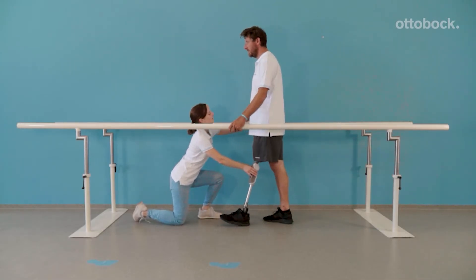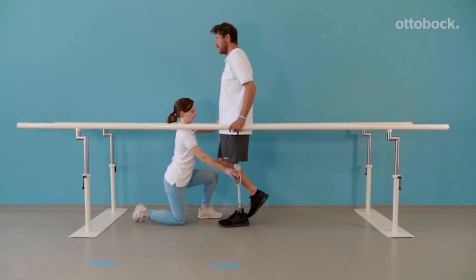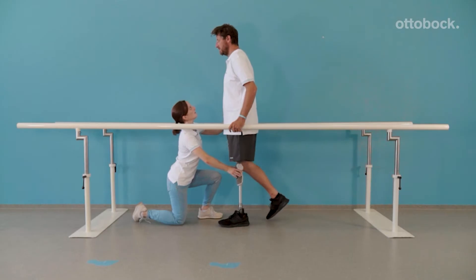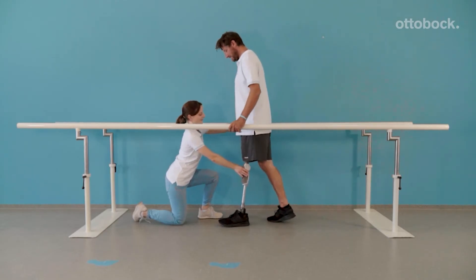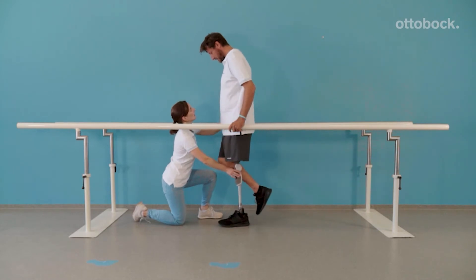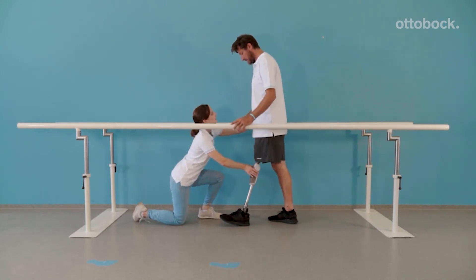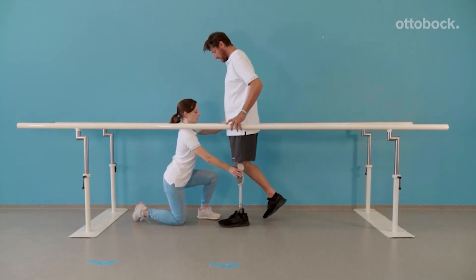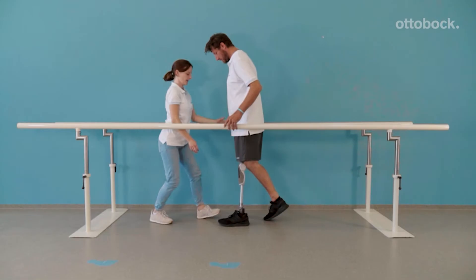The therapist guides the weight shift through the entire stance phase if required. Observe how the trunk and the pelvis simultaneously move forward. Once the model is able to do this well, he can practice without support.